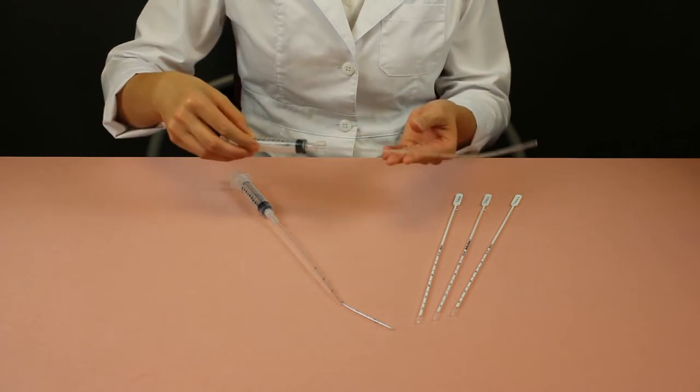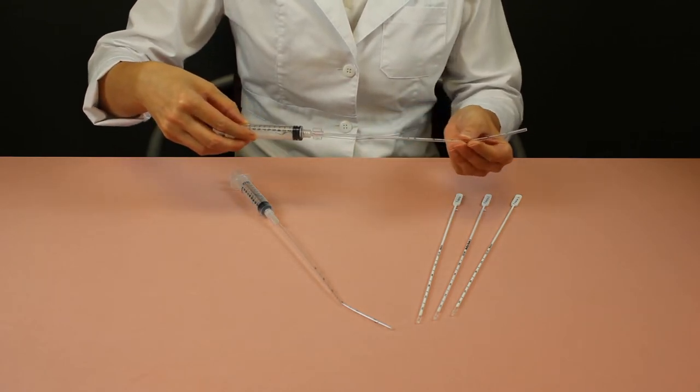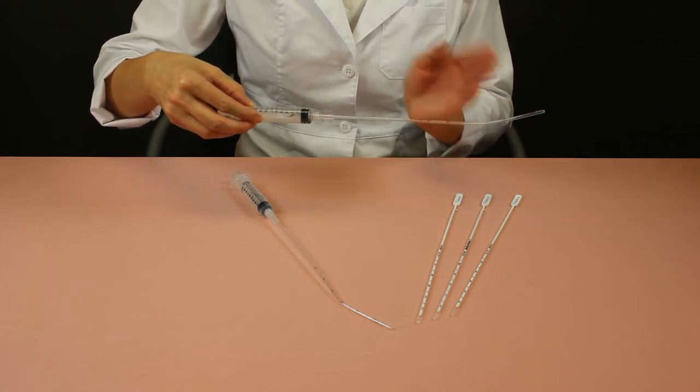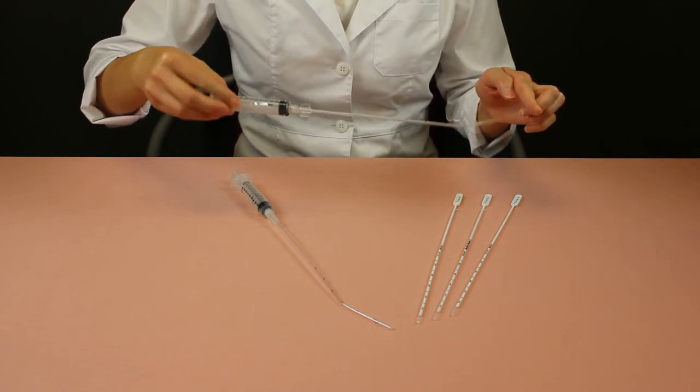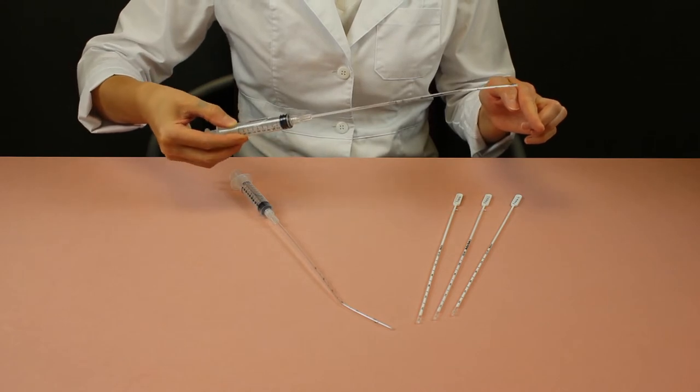At its core, the device is a 3mm semi-rigid curette attached to a 10cc syringe. The hole in the curette has a cutting edge that collects a better sample of live endometrium.